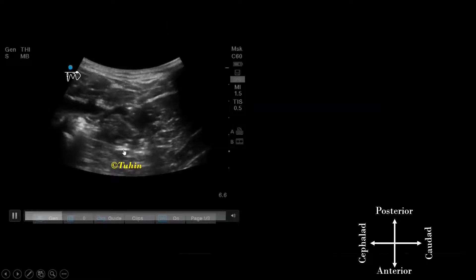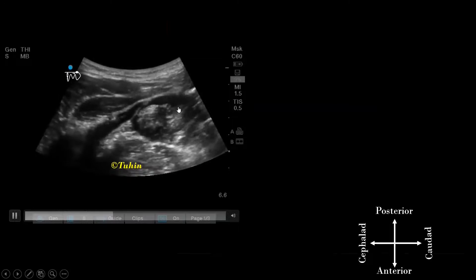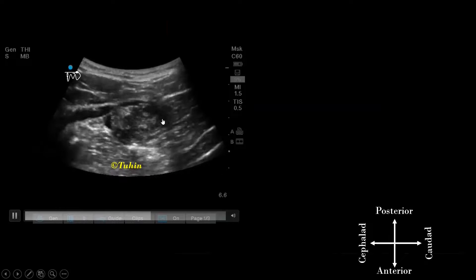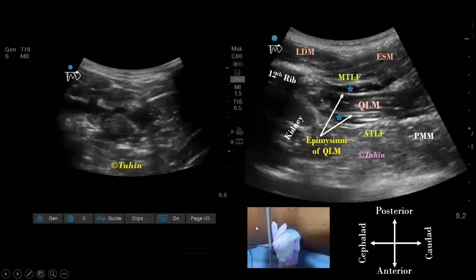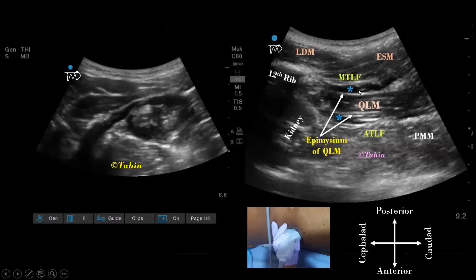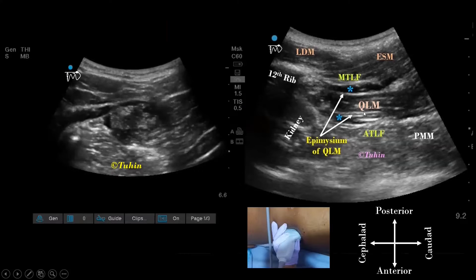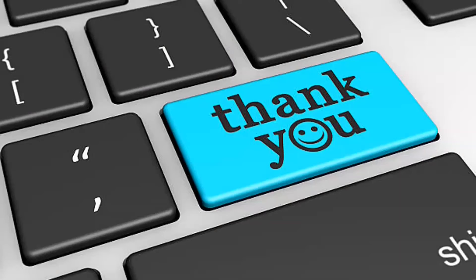As you can see here, post-block scanning reveals a nice layer of local anesthetic between the thoracolumbar fascia and the epimysium of the QL muscle. In the subcostal or oblique sagittal view, craniocaudal spread was observed both anterior and posterior to the QL muscle, confirming correct deposition of the local anesthetic.